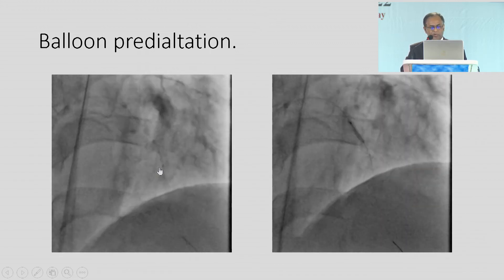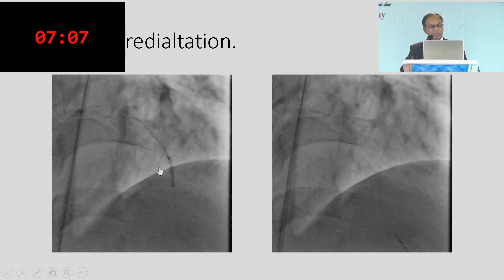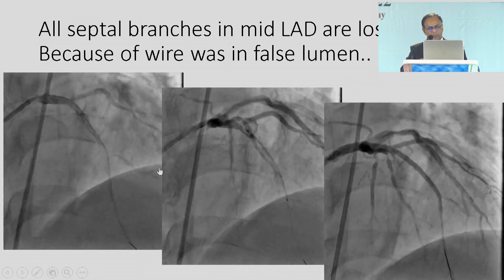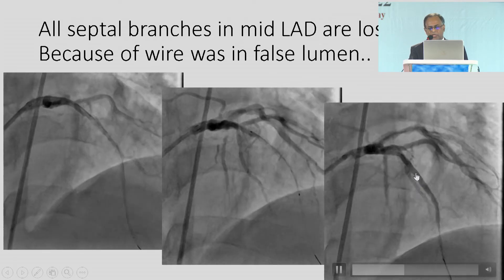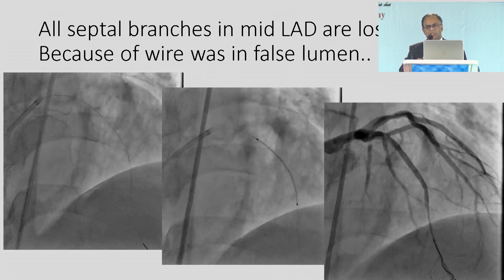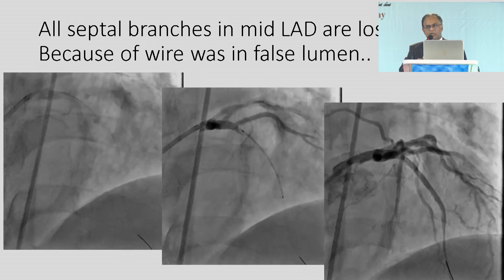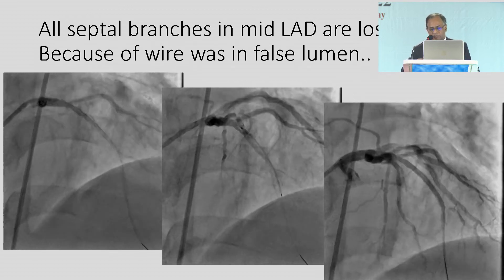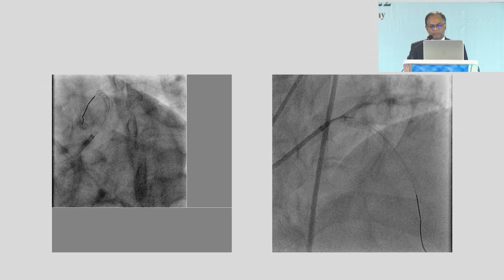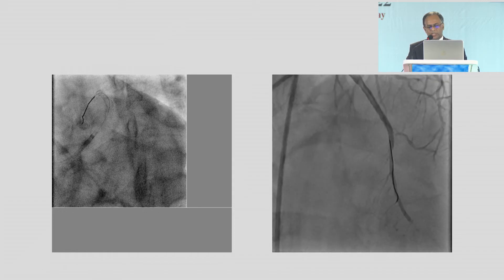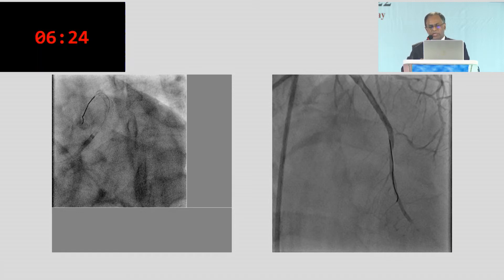I did balloon dilation — first with a smaller balloon, then progressively with a bigger balloon. All the septal branches in the mid and part of the distal LAD were lost. Do you think there is a totally bald area in the mid-LAD? There was a lot of septum initially if you see — all are now lost. The patient developed tachycardia on IV inotropes but was still hypotensive. I placed a stent and did post-dilation. Distal flow improved, but by this time anteroseptal MI had developed due to loss of septal branches in the mid and proximal LAD.